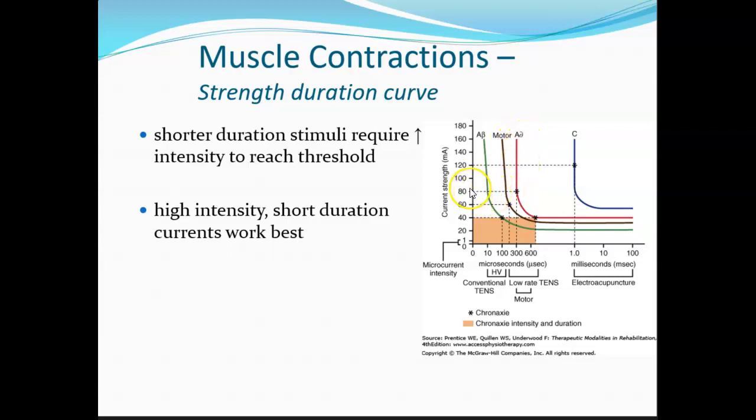But if we turn it up to 80, right? Let's say if we turn it up to 80, then that's where we're going to start to get some pain. Well, we don't have to turn it up to 80. Look, we can just keep it at 40. The pain nerves don't even know we're here. Oh, we want to contract? Well, let's turn it up to 60. Come on, the pain nerves won't even know we're here. Why is he talking like this? This is annoying. I don't want to listen to this. All right, so I'll talk normal.